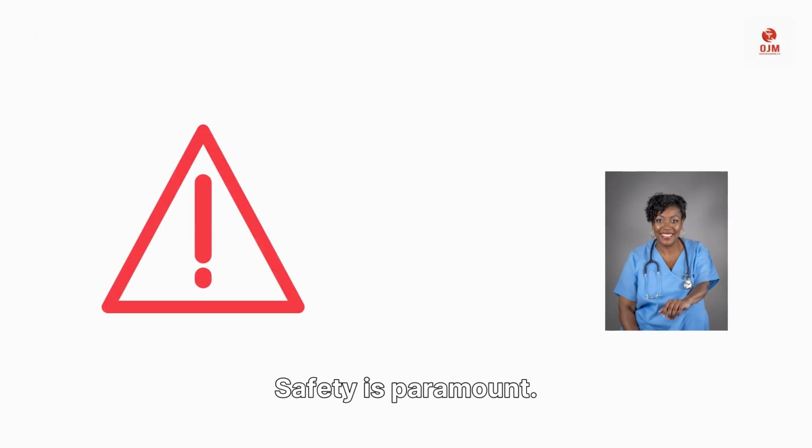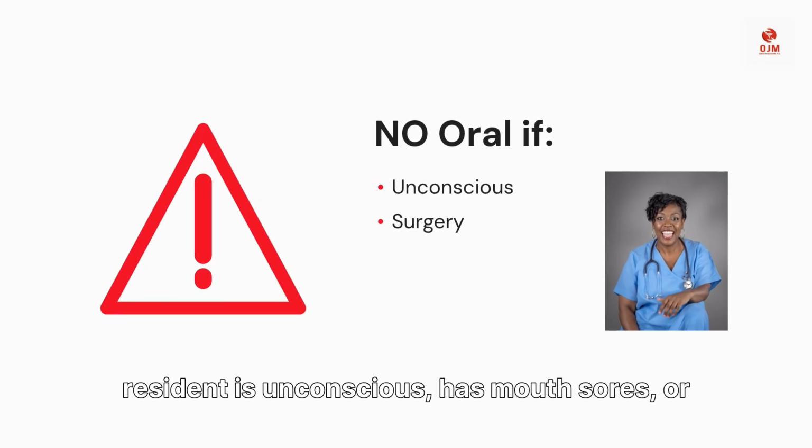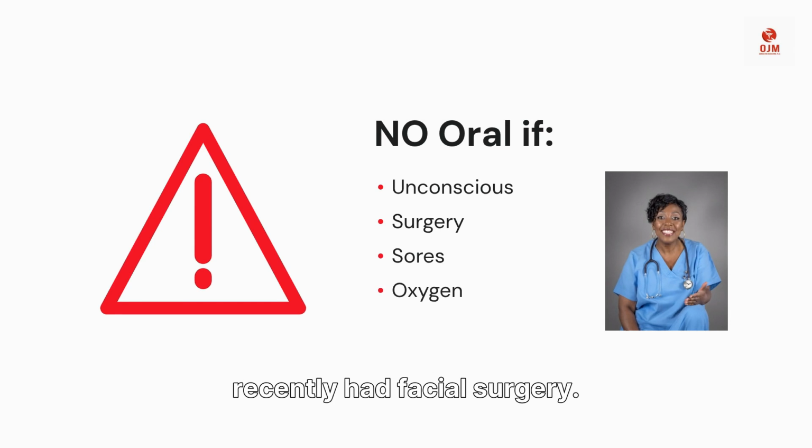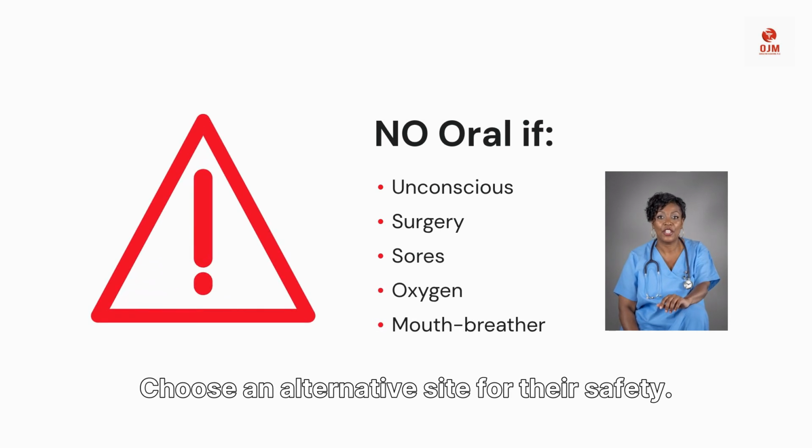Safety is paramount. Never take an oral temperature if a resident is unconscious, has mouth sores, or recently had facial surgery. Choose an alternative site for their safety.